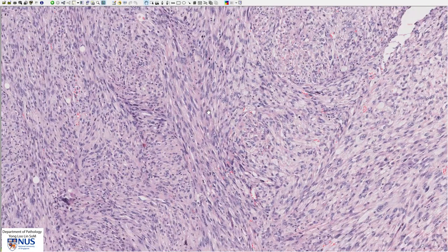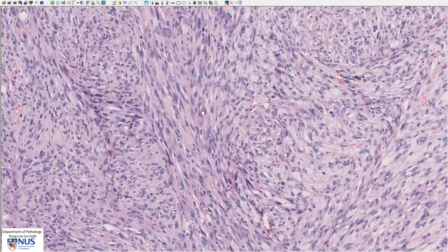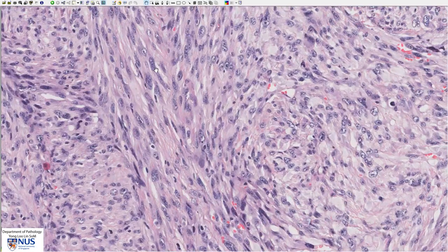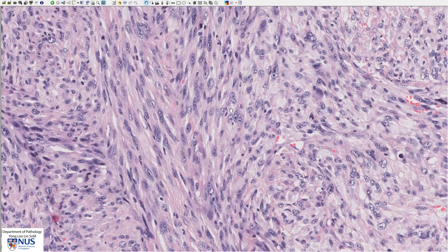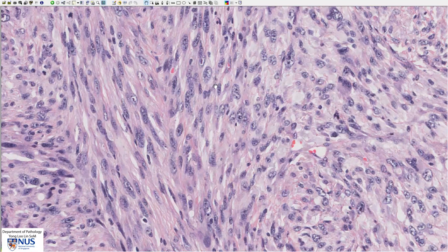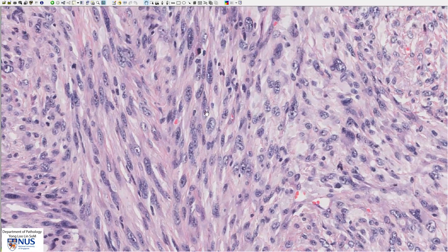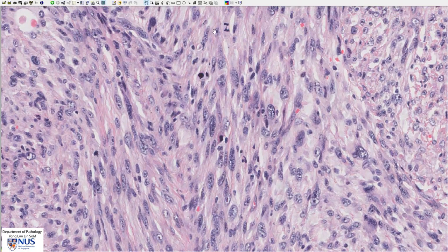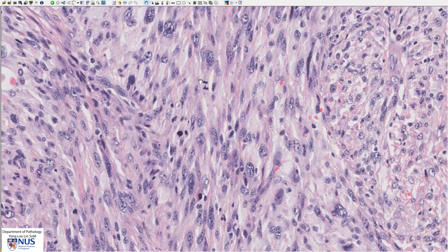These spindle cells show nuclei which are fairly large. Some of them have prominent nucleoli and quite coarse chromatin, and there is a moderate degree of nuclear pleomorphism with a moderate difference in nuclear size and shape as we look around.